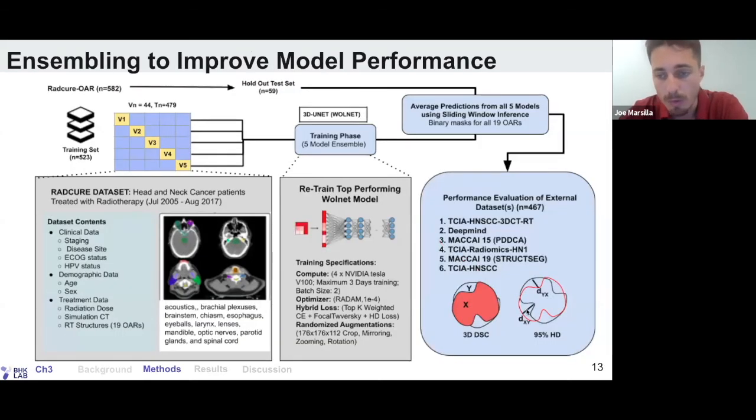This is an overview of what was done, our model of choice that we will give you packaged, that you probably have access to if you clone that GitHub repo. Basically, we built an ensemble with a basic UNet-type architecture over 580 patients or so, using 5-fold cross-validation. We trained this simple network, made the ensemble, and applied it on 6 external data sets after it was finally trained.